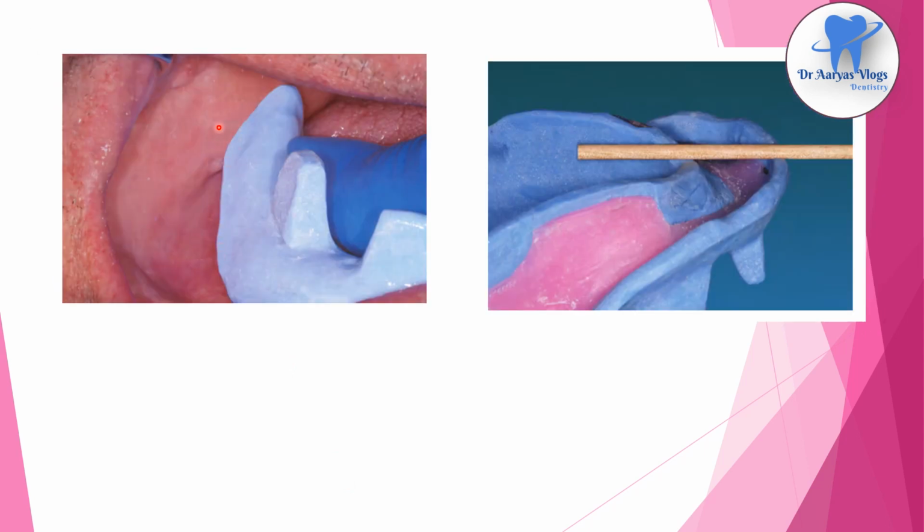Here the fatty roll of tissue in the masseter muscle must be removed from beneath the impression tray when evaluating the extension of the tray. And there should not be any sharp corners in the tissues in this area. And for most of the patients, labial and buccal, lingual flange will be of equal length unless any surgical extension of the vestibular notch or severe bone loss resulting in the genial tubercle being elevated.